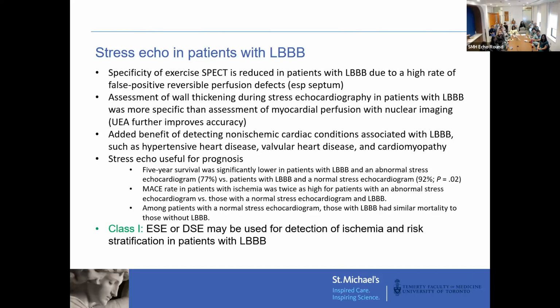Also, a quick comment about patients with left bundle branch block. The only reason I bring this up is because often we identify them as being difficult to evaluate. Their GXT is non-interpretable, so sometimes these patients get sent for exercise nuclear testing, but keep in mind left bundle branch block can cause an artifact in the septum in nuclear testing. Unless you have very experienced nuclear readers, that can be overcalled and end up with unnecessary testing.